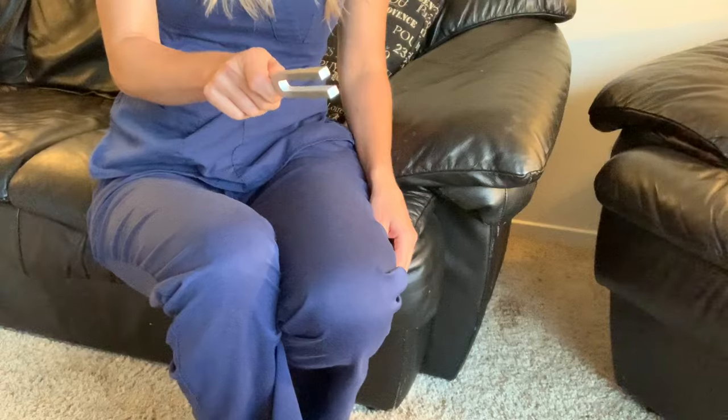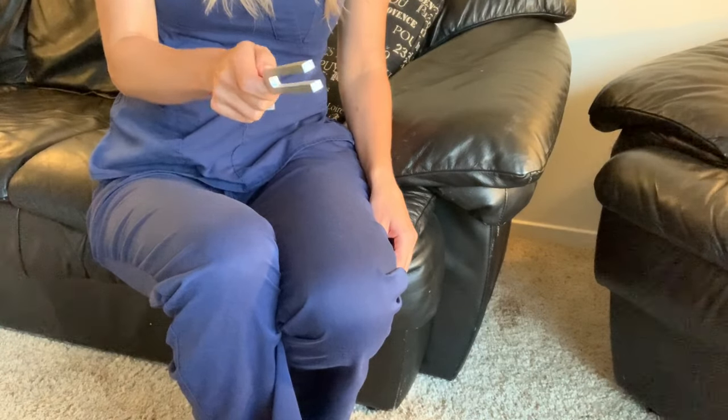We're going to start with the Weber test, which evaluates for unilateral hearing loss, or hearing loss in one ear. To activate the tuning fork, you can strike it on the elbow or you can strike it on the knee. You don't want to strike the tuning fork on a hard object such as a table because that can damage the tuning fork and produce overtones, which can affect the test results.